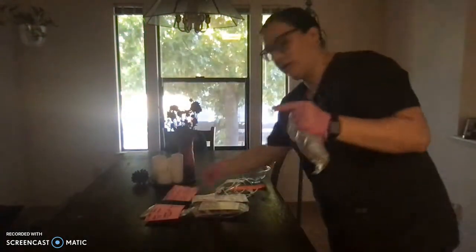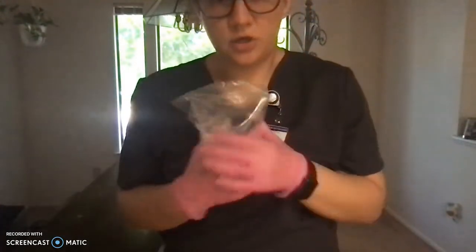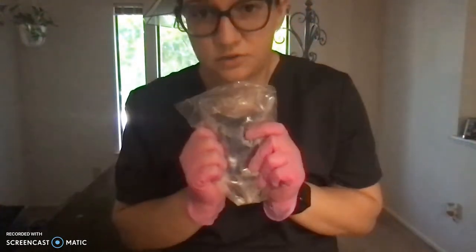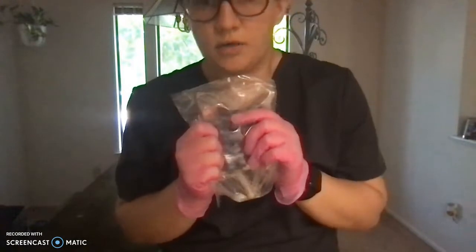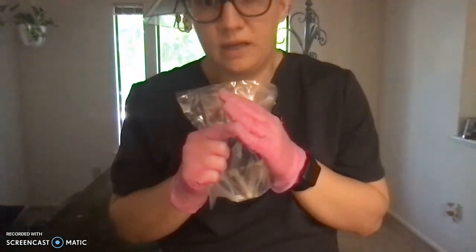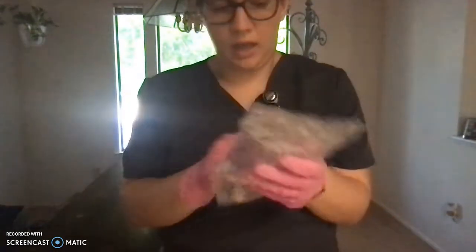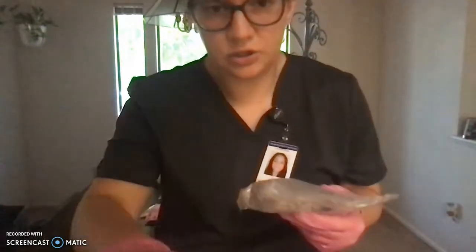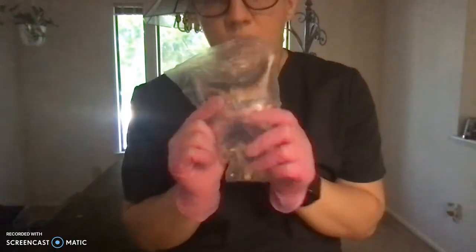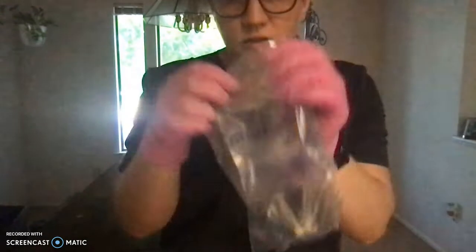We will round up. Now that we've clarified our orders, we make sure our 6 rights have been completed. Our 6 rights include right patient, right dose, right time, right medication, right documentation, right route, and of course right indication as well. The first thing we do when we pick up our IV is check the expiration date and that everything is sealed and has not been tampered with. We'll go ahead and open this.